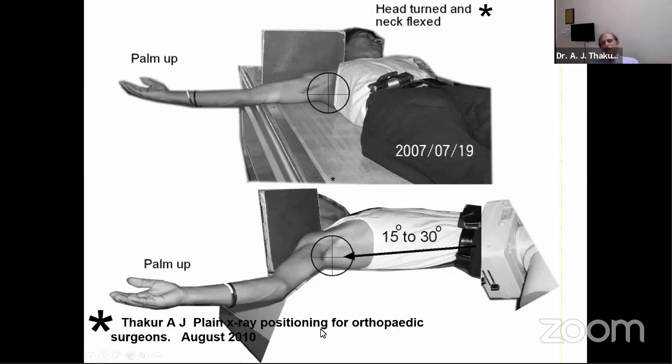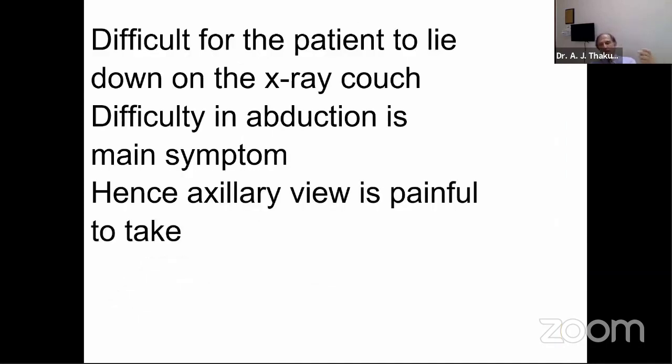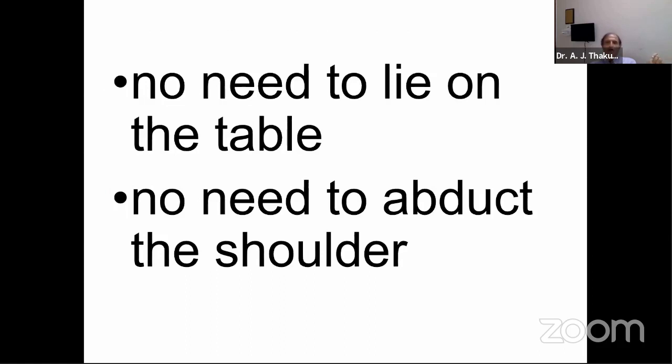This is fine if the patient has a full painless abduction. This X-ray can be taken very easily. However, in fracture or in other conditions where the patient cannot abduct, it is very difficult. It's difficult for the patient to lie down on the X-ray couch. It's difficult to abduct. Hence, the axillary view is painful. Certainly, in fracture, it is extremely painful.